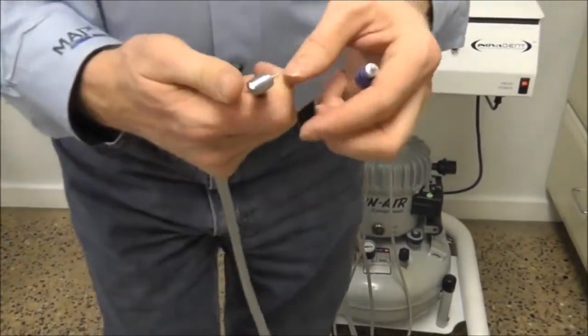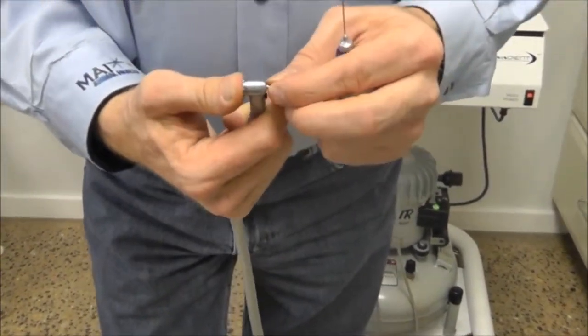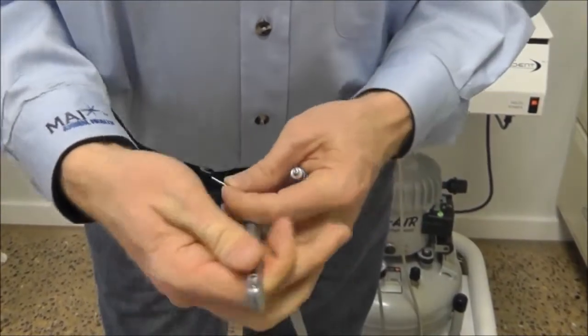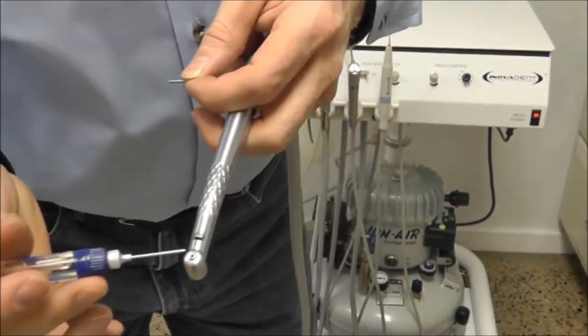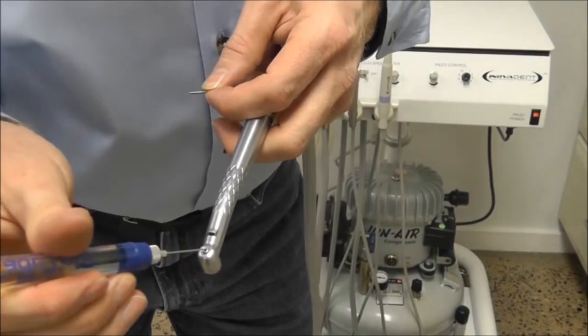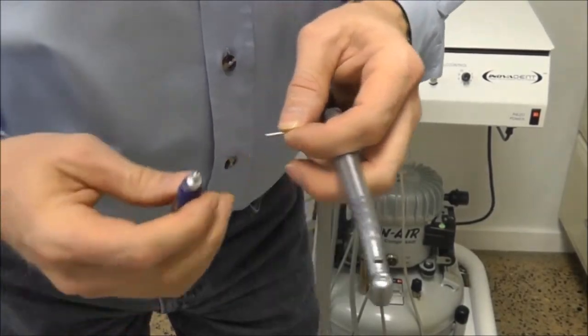On our high speed unit, remove the burr and place a drop of oil right down the port where the burr goes into the turbine.